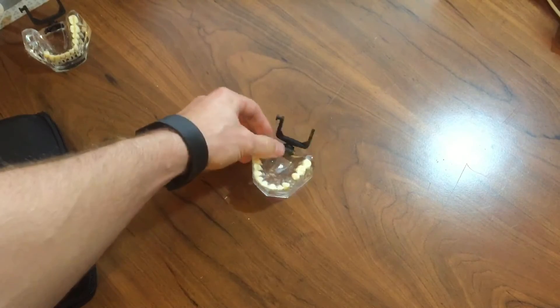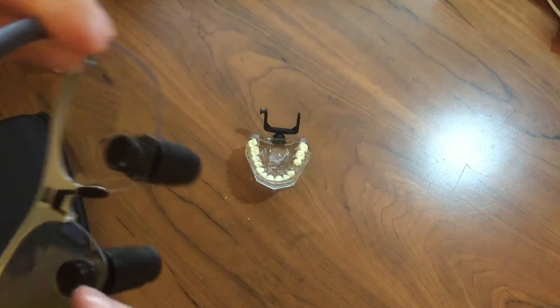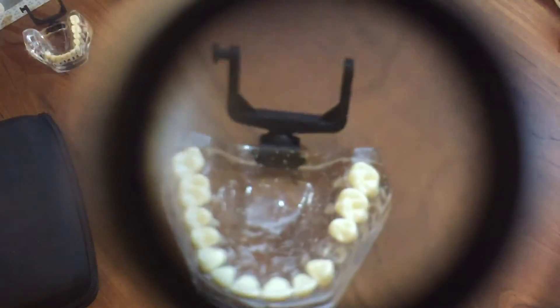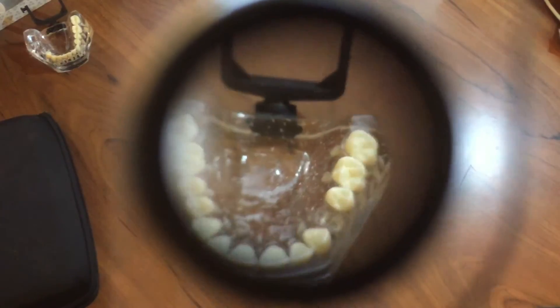I want to try to give a little bit of an example of the magnification that we're looking at here. There's my Typodont and I'm going to try to put the loop up to my camera and see if we can get a little glimpse. So that is about the magnification of the loop — without and with. It's a very significant magnification and obviously if you're going to be doing procedures you're going to be looking closer. That gives you an idea of the type of magnification you've got going on here. It's very, very good — I'm very impressed, I like them a lot.